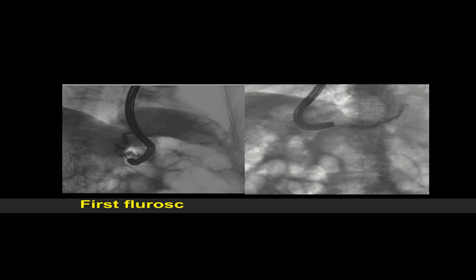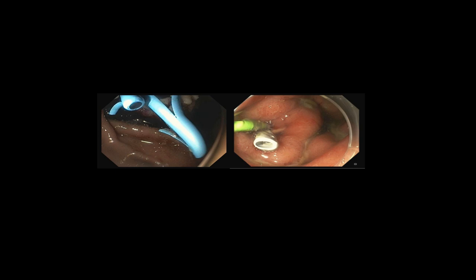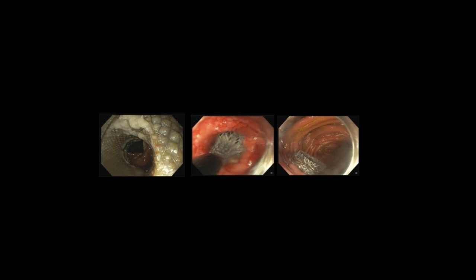On pancreatogram, the duct appeared to be decompressed and straighter compared to prior, and to maintain the patency of the de novo created pancreaticogastrostomy, a 9 mm balloon was used to sweep the duct and a small amount of white particulate matter was removed. Two new upsized 7 French and 8.5 French pancreatic duct plastic stents were placed. And to prevent further tissue ingrowth into the stent, the LAMS was removed with the rat tooth and replaced with a new 20x10 mm stent.